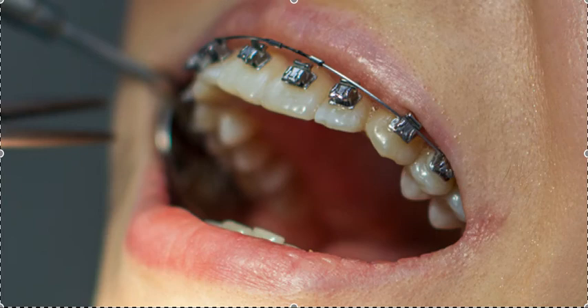Hey, it's Dr. Amanda with Straight Smile Solutions, straightsmilesolutions.com. Today we're going to talk about the difference between self-ligating — also known as Damon braces — versus traditional braces, which are held on with a little rubber tie. I have a picture here of the self-ligating bracket. Most of you know what traditional braces look like: the wire sits in the bracket and there's a little rubber tie that goes over it, often in different colors.